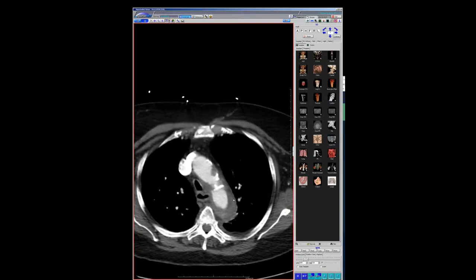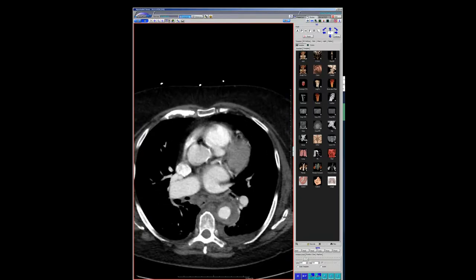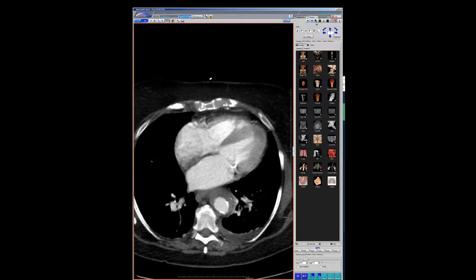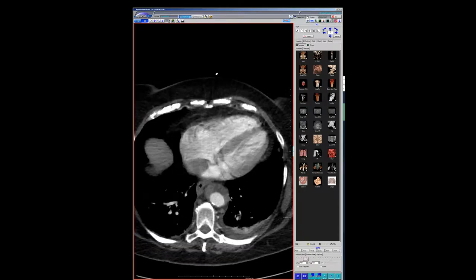That's precisely mine as well. They're pseudoaneurysms of those vessels. Yeah, it's like the vessel shears off where it inserts into the aortic lumen just because of the change in the wall. Yeah. That's my understanding. That's my understanding too. I may be wrong, but that's kind of what I've always thought. Thank you. All right, those are my cases.